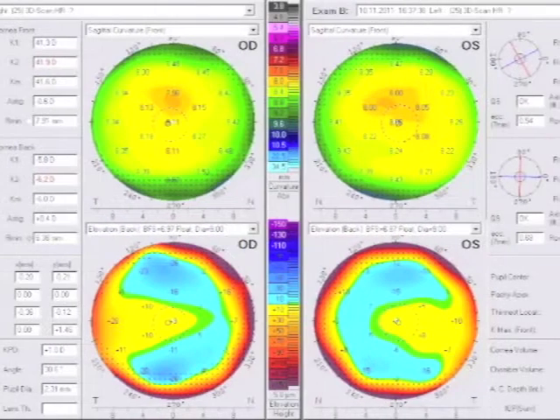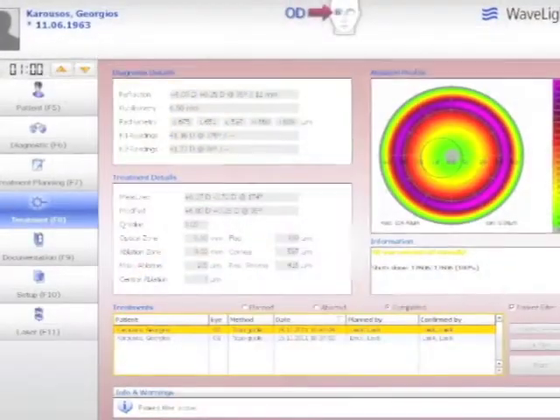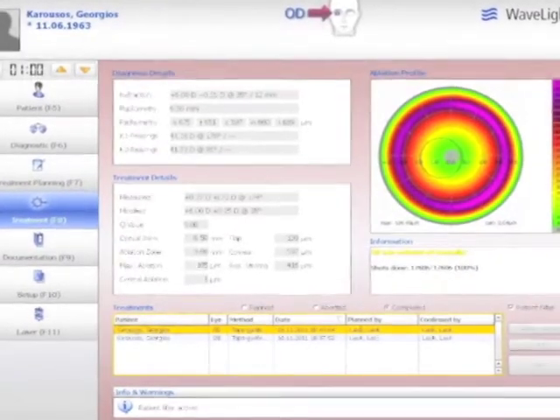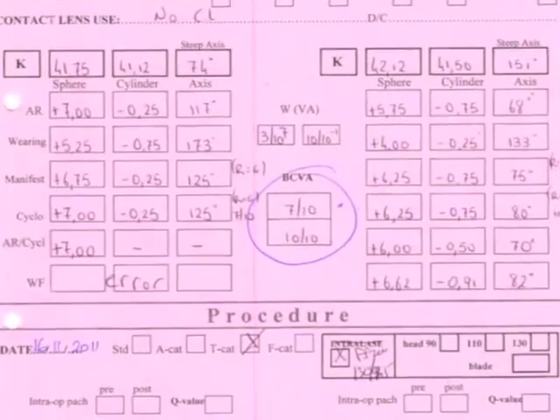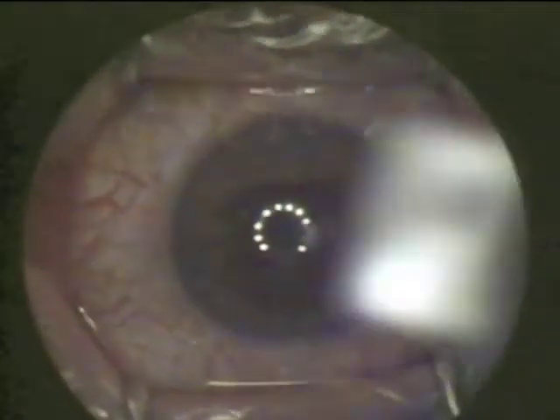This is both eyes of this hyperopic patient. We'll see the treatment data in a few seconds. You can see we're talking about a very significant hyperope. We're at a +7, minus 1.5 astigmatism that we'll be treating, and directly into surgery. The patient interface suction goes on right now, at this moment that the FS200 patient interface touches the cornea.